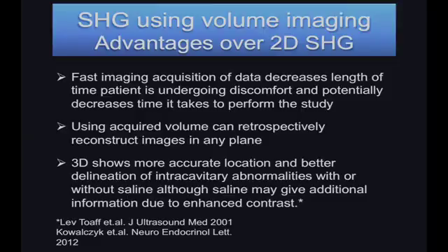And then the 3D shows a more accurate location and better delineation of intracavitary abnormalities, actually with or even without saline, although the saline may give additional information due to enhanced contrast, which was actually shown in a couple of reports by Levtov and then Kowalczyk.